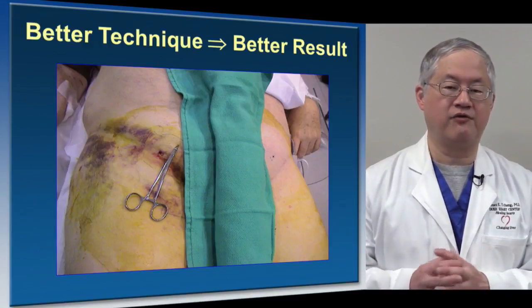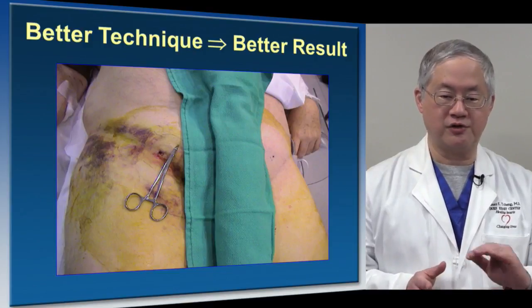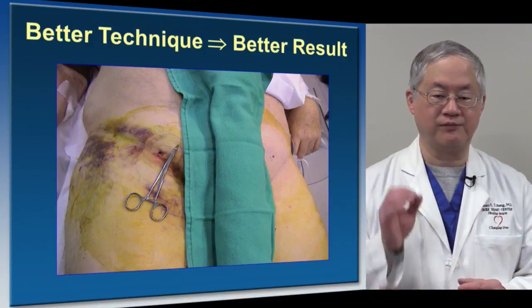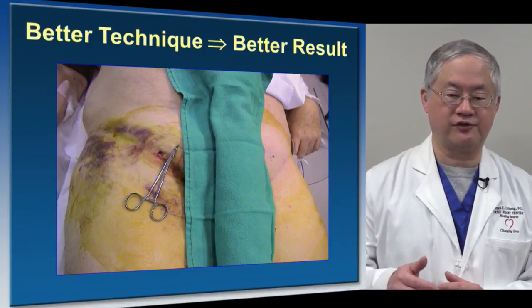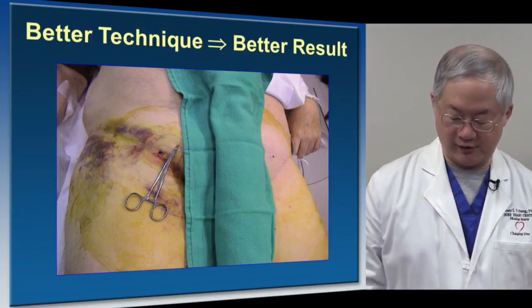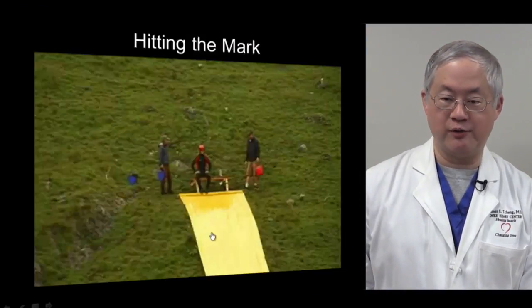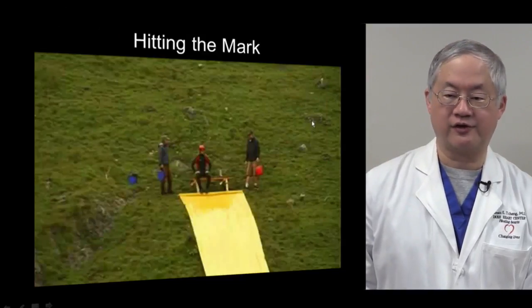As you're thinking about getting femoral venous access, still some of the same principles hold. You should make sure that you understand what your anatomy is. You try not to stick the artery, but the place I would actually recommend that you stick is in the femoral crease, mainly because then you have the least distance to go, and as you pull things out, the amount of pressure that you have to place is relatively modest. So let me close then with this graphic, which I hope you will enjoy, that explains what it is that we're asking you to do in terms of vascular access.